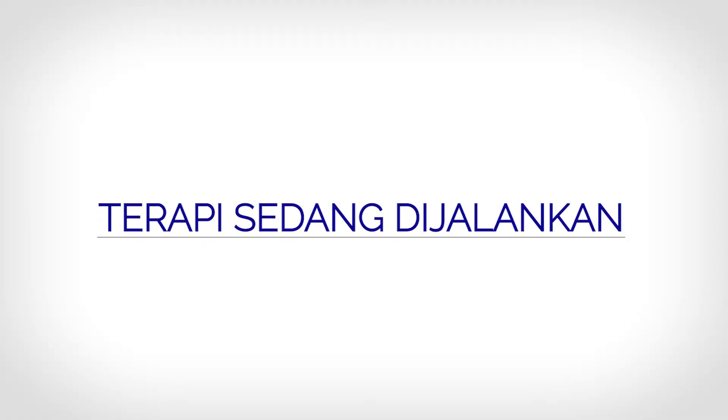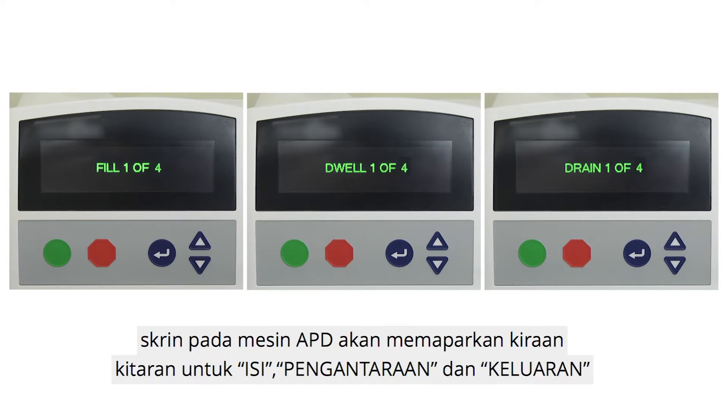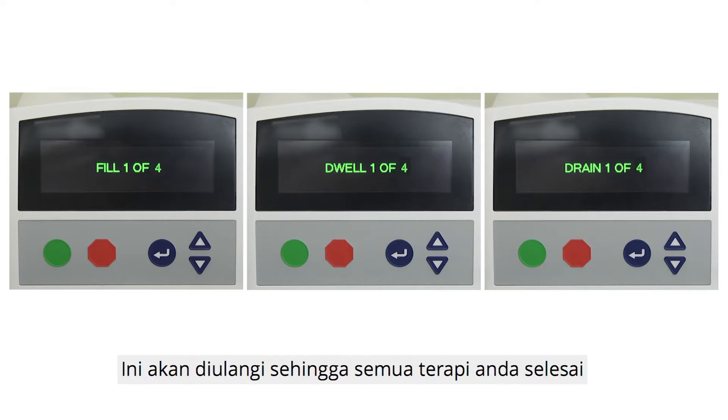Therapy in progress. Once Initial Drain is completed, the screen on the APD machine will show the cycle counts for Fill, Dwell, and Drain. After you have completed one full cycle, a new cycle of Fill, Dwell, and Drain will begin. This will be repeated until your entire therapy is completed.